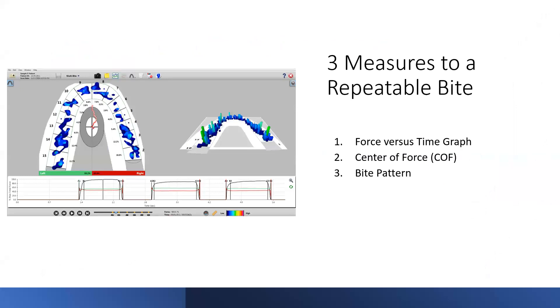The way we look at a multibyte scan and prove the repeatability is we use three different measures — I like to call them three buckets, or checking off a list of three items. The first is the force versus time graph, which is the graph at the bottom of your screen — a timeline of the entire recording. The second is the center of force, the red line running through the center of the 2D force view. And third is the overall bite pattern, either the 2D or 3D view.